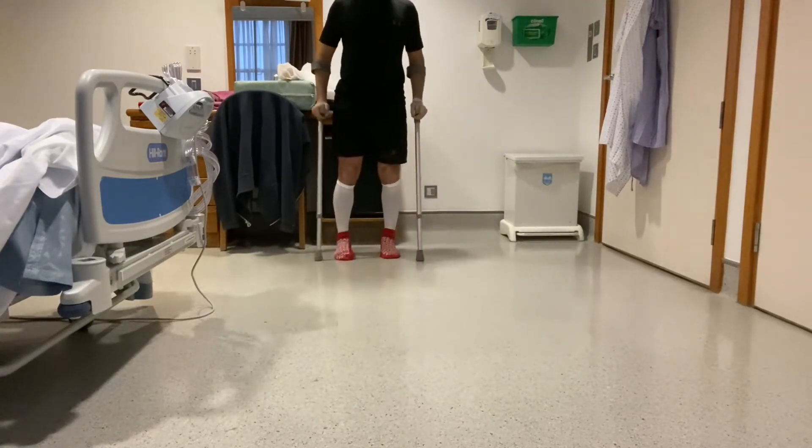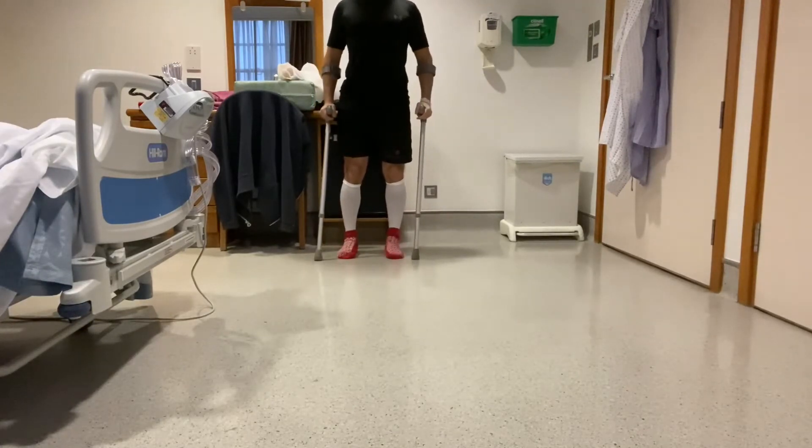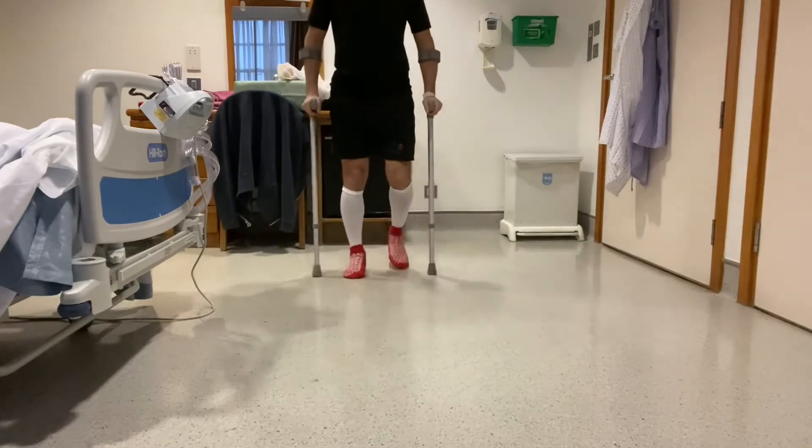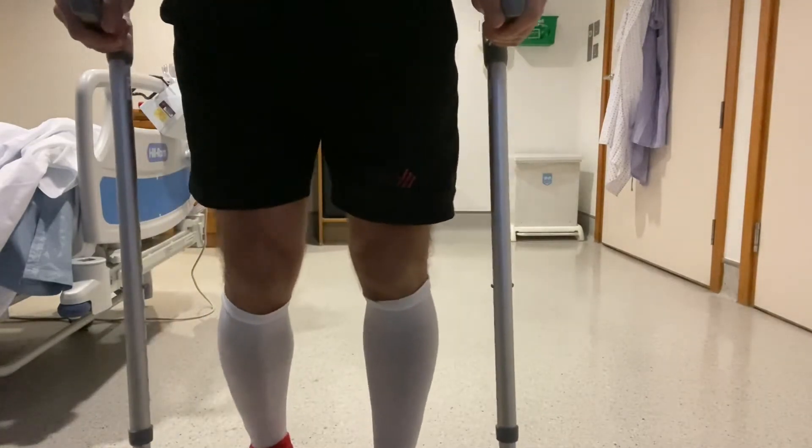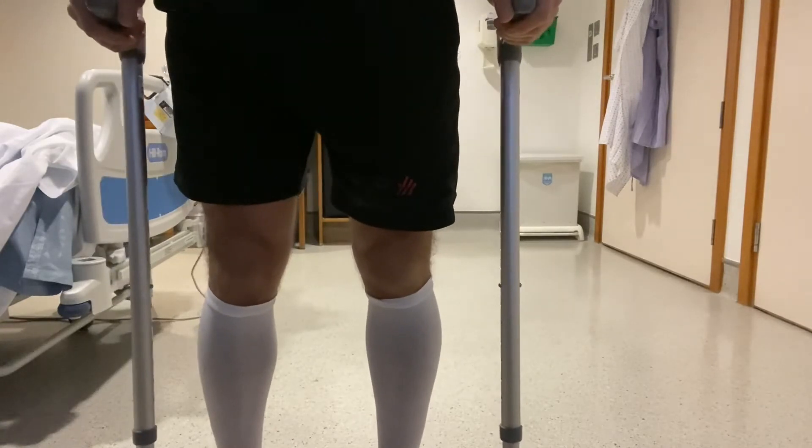Just make sure that you keep your posture upright, don't look down at the ground, and focus on keeping your hips level so there's no lateral weight shift when you walk.